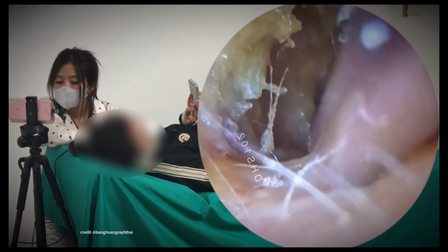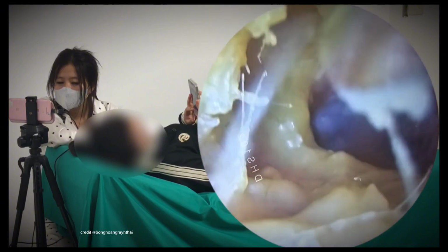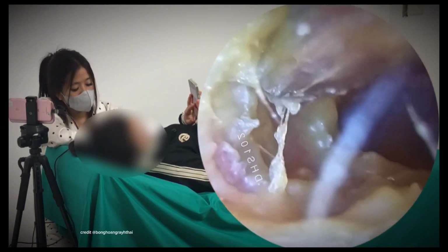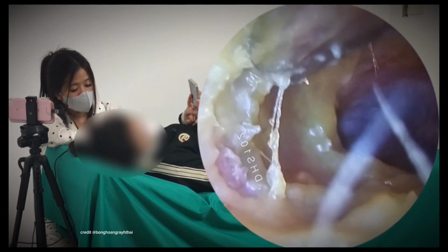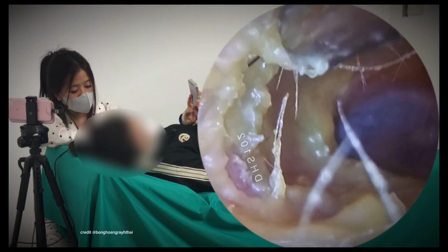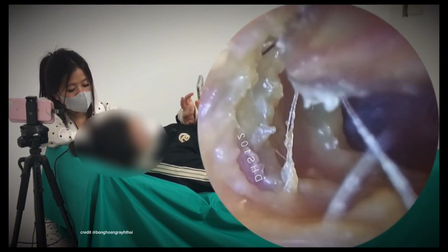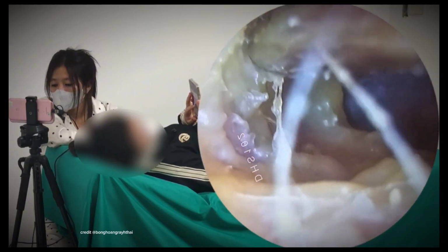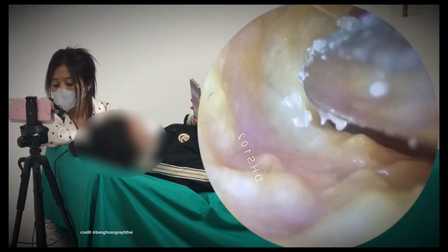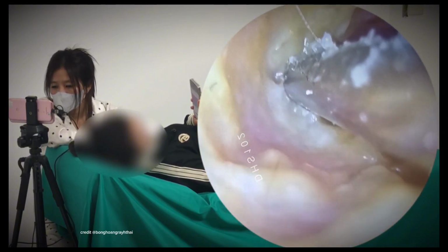We're not going to be able to get all of this wet dead skin because, again, because it's infected, the skin is very, very sensitive, and we certainly don't want to be poking around in there. We certainly don't want to cause any bleeding. This patient will then be in line for drops.